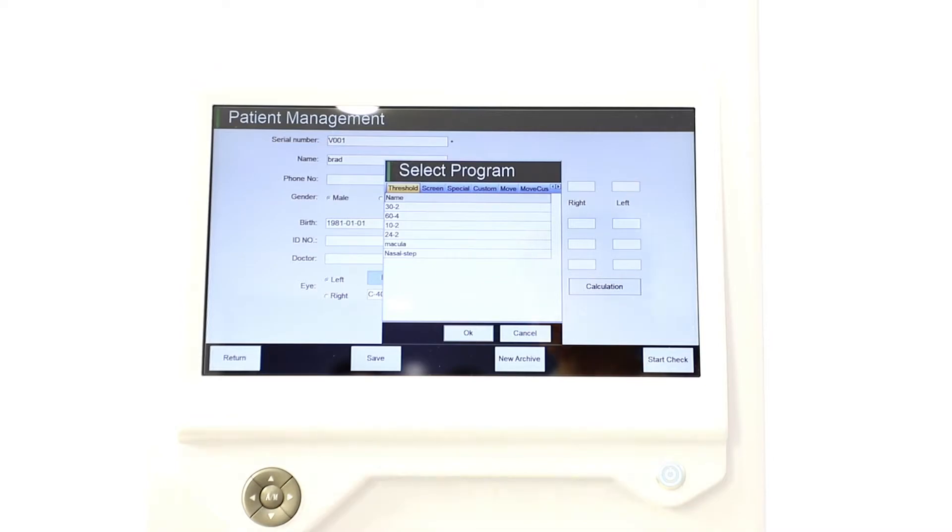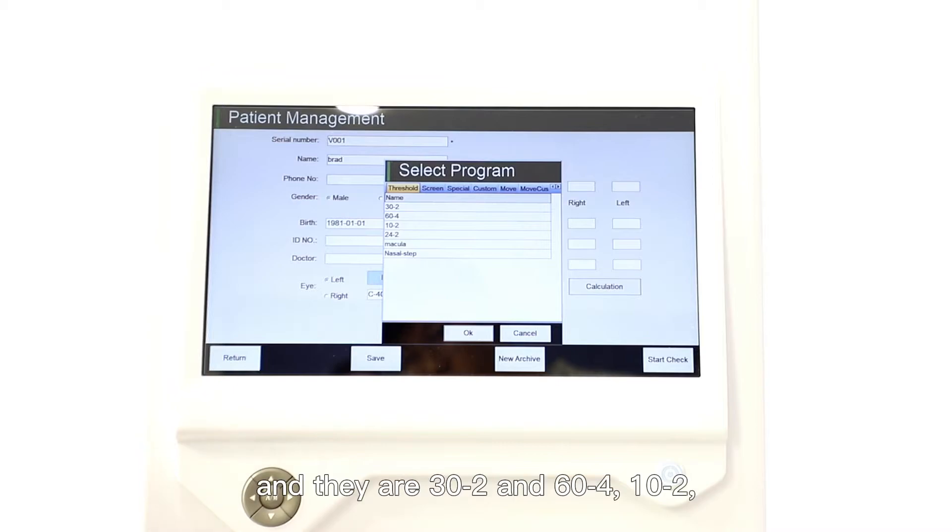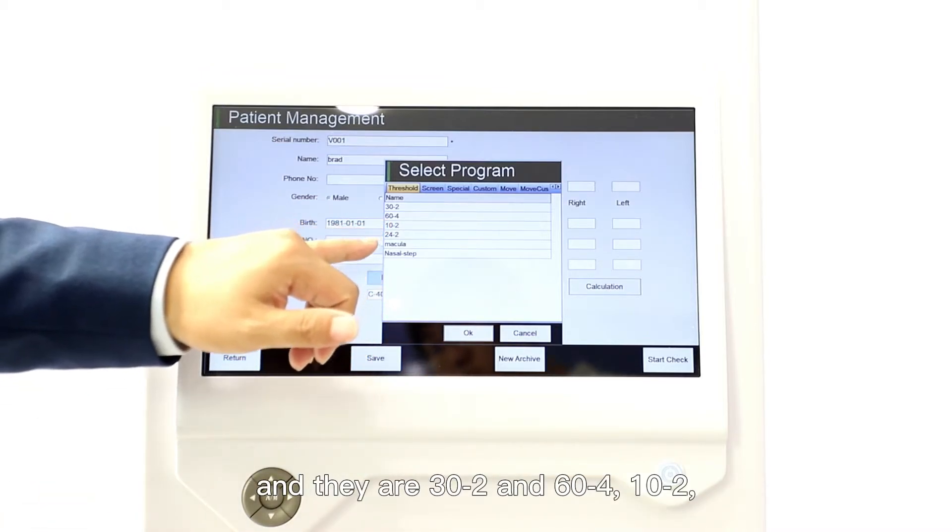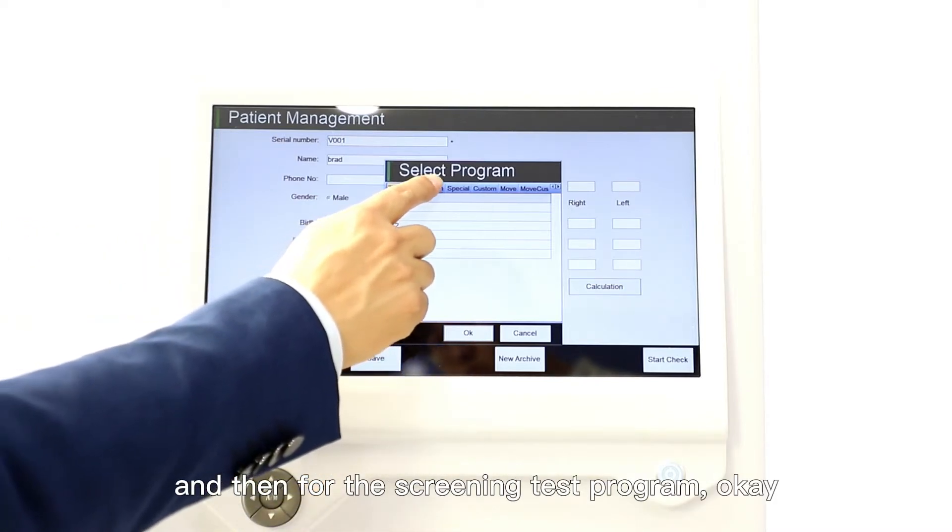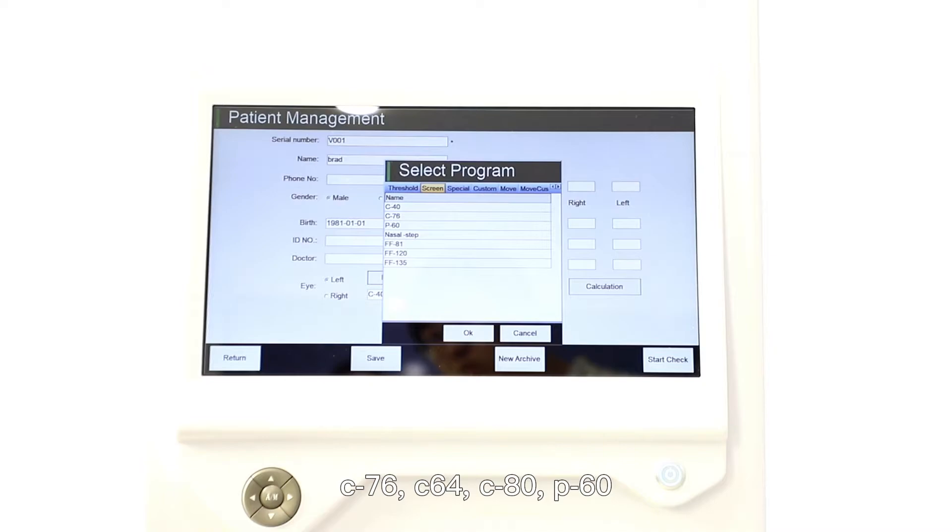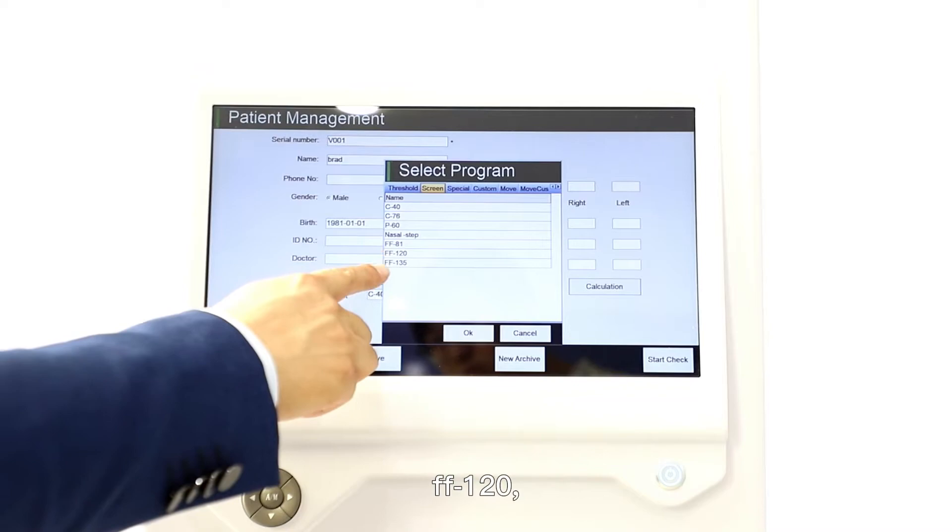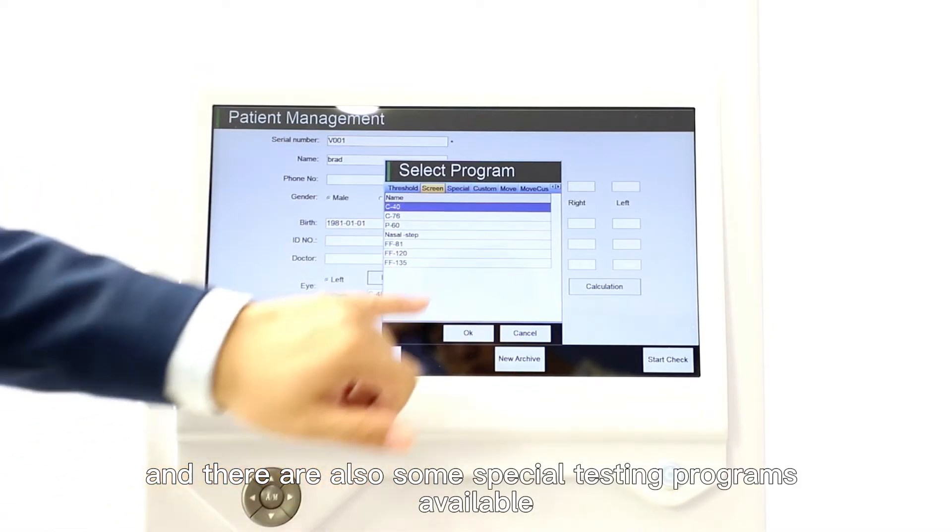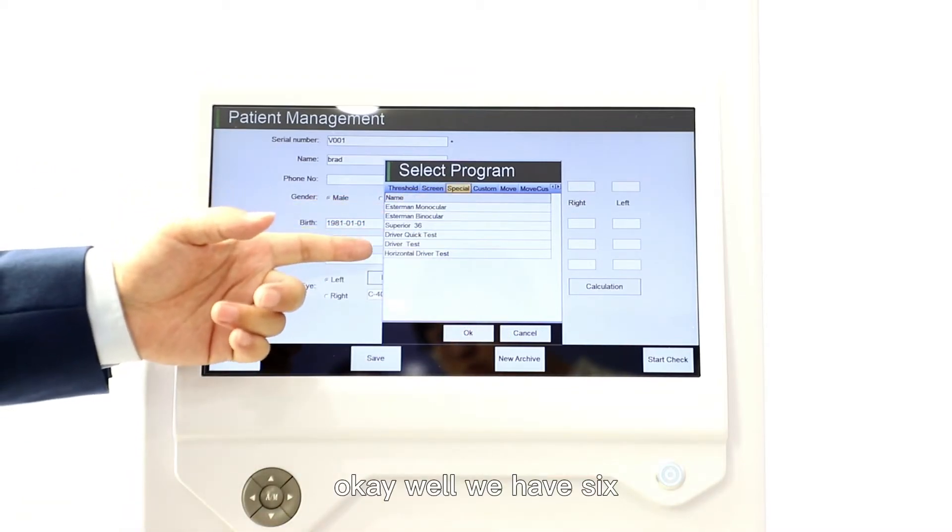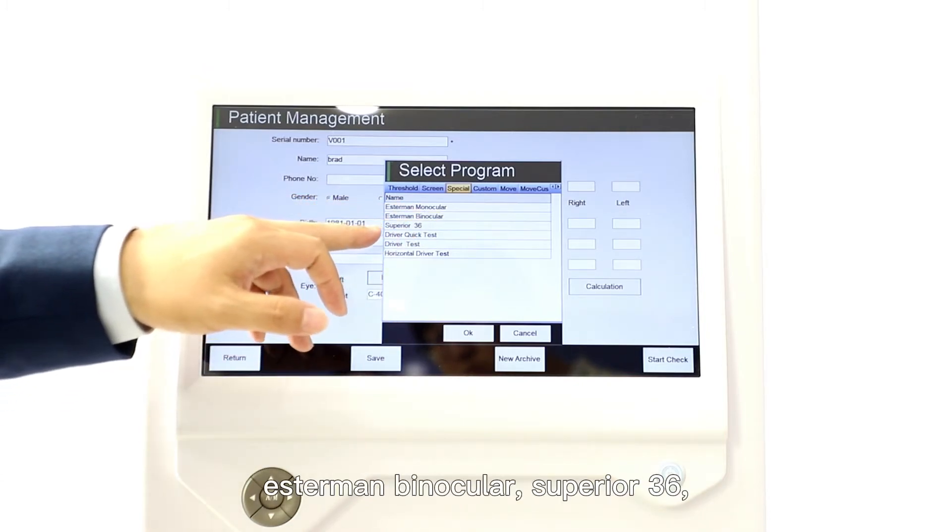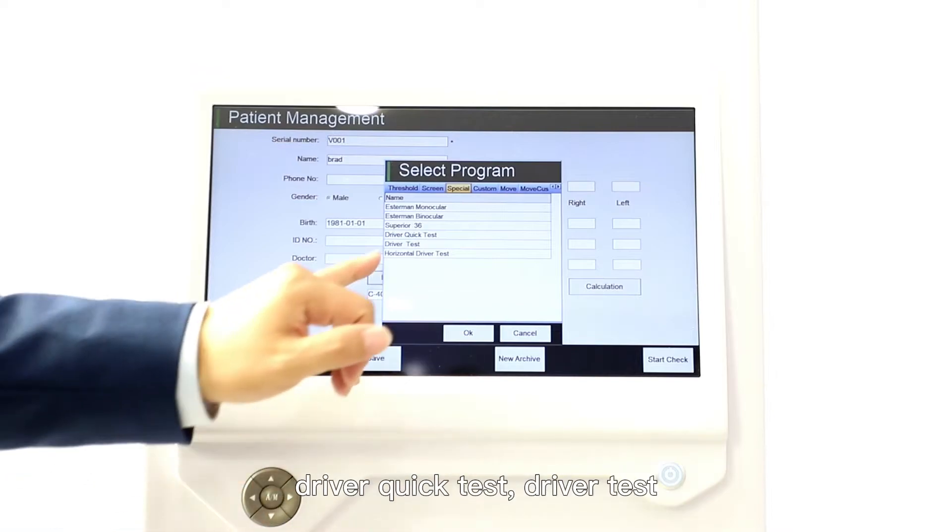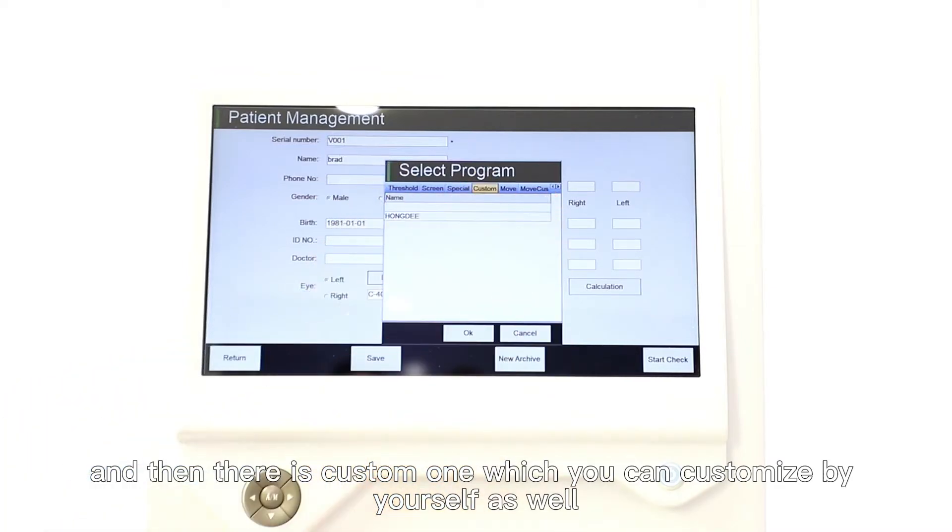It has threshold testing programs, screening testing programs, special test programs, and custom test programs. For the threshold testing program there are six: 30-2, 60-4, 10-2, 24-2 macular, and Nasal Step. For the screening test programs, there are also seven testing programs like C40, C76, P60, Nasal Step, FF81, FF120, FF135.